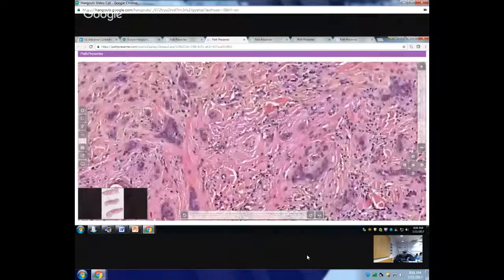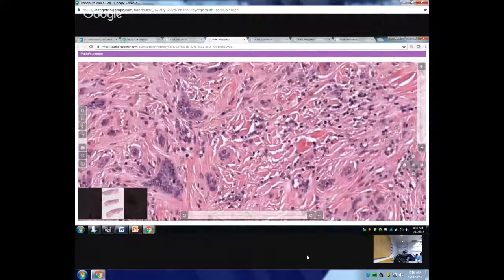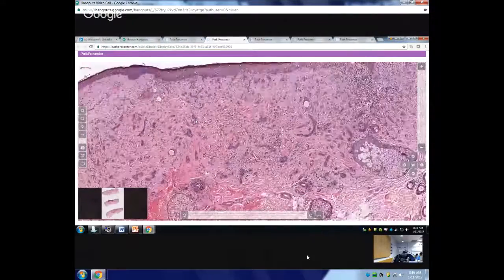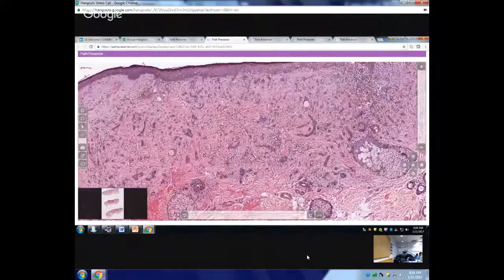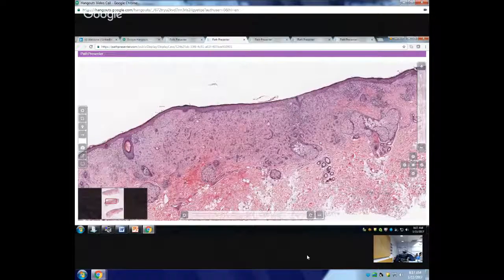So if you see something like this, which is an infiltrating basaloid neoplasm but doesn't have all the other features of a basal cell carcinoma, your main differential diagnosis is a trichoepithelioma and a microcystic adnexal carcinoma. Both of them are going to have the keratocyst, but the microcystic adnexal carcinoma, as the name suggests, is very infiltrative. It is a carcinoma, so it is going to be very infiltrative, going almost up to the subcutis. And this one is not; it is up to the mid dermis actually.